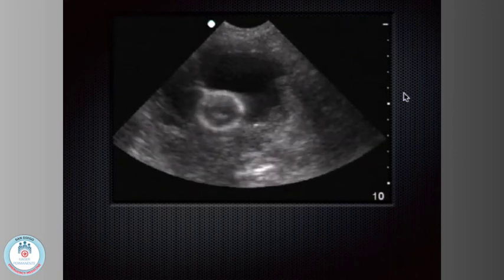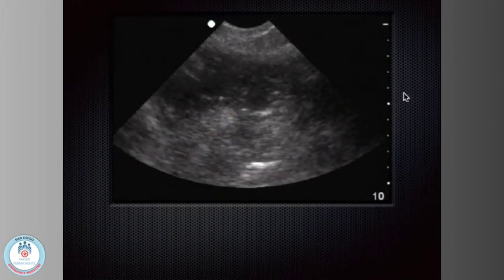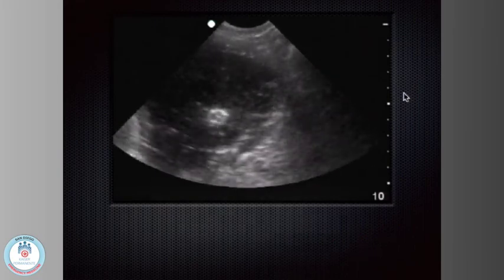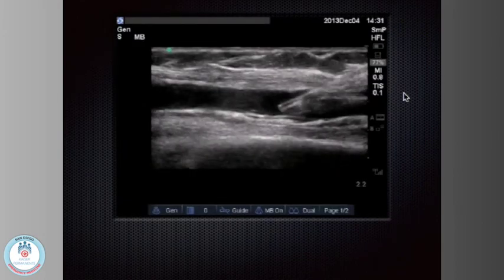If you can imagine just taking an 18-gauge needle and getting the balloon to pop, there's a way to do that. And the urologists hate this because they have to go in and get all those pieces out using cystoscopy. But yeah, I always tell the patients, you don't want to pull that out if you ever want to cough with confidence ever again in the future.